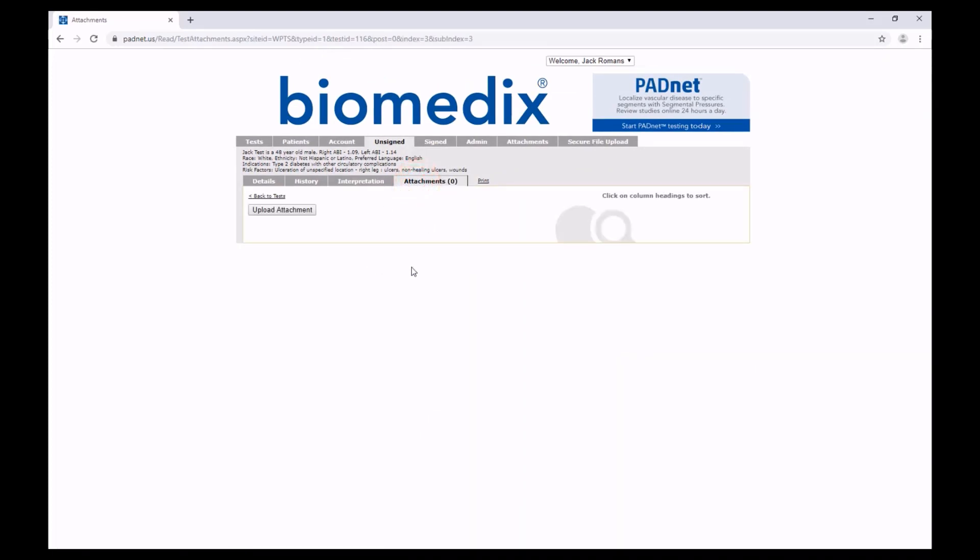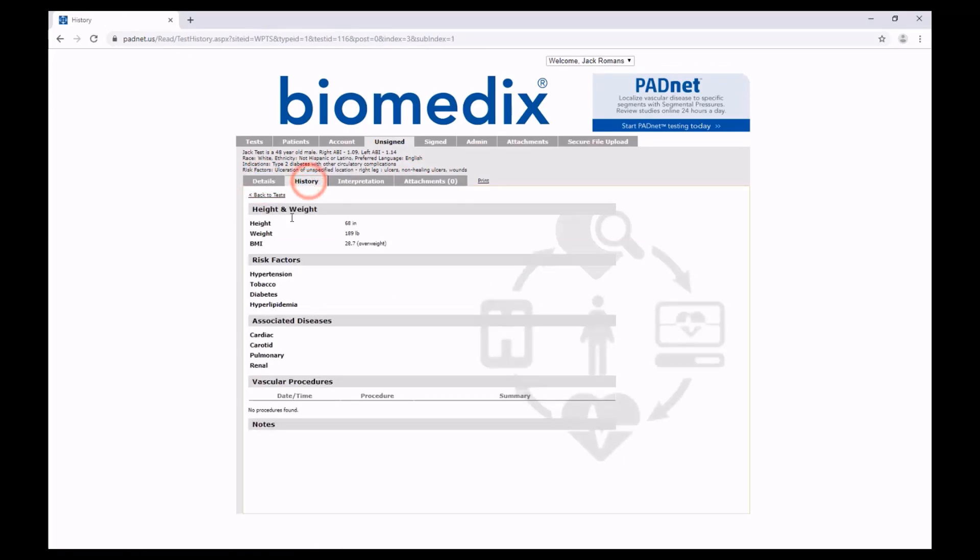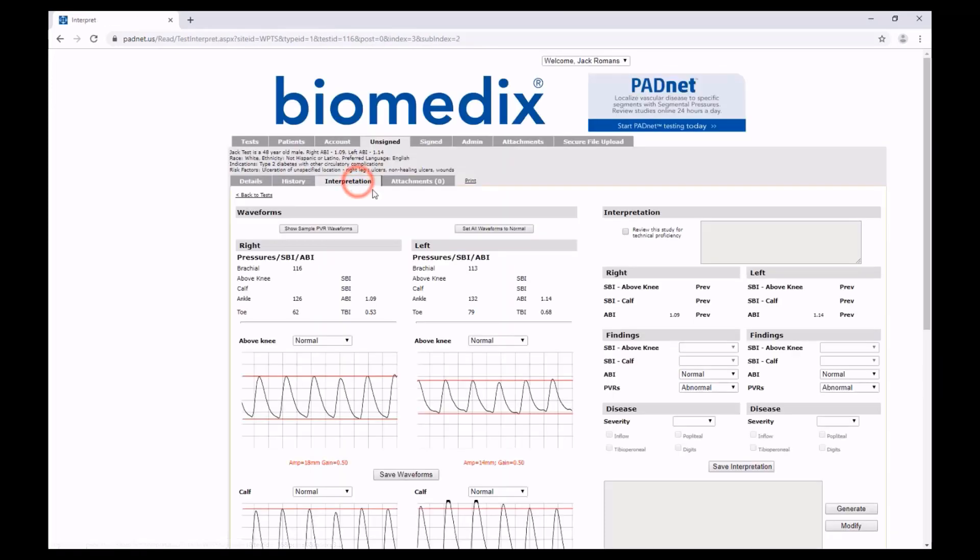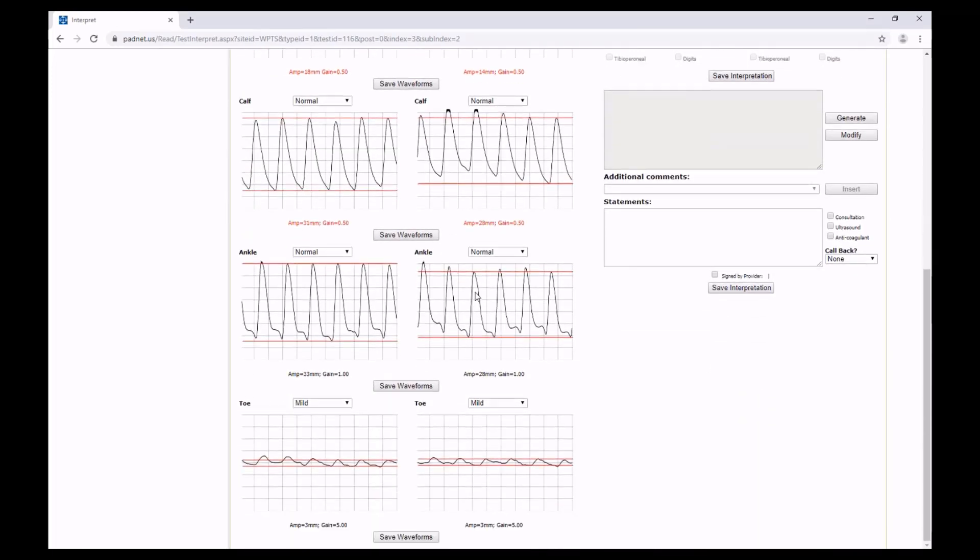Again, you can look at any attachments and upload any attachments if you'd like, and at any point you can look at the details of the patient, the history of the patient, or return to your interpretation.